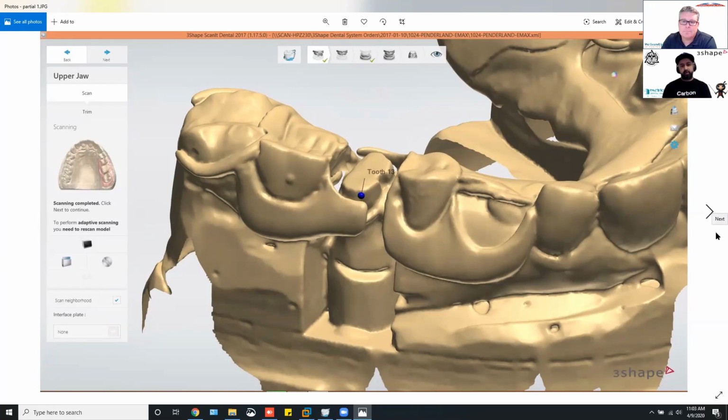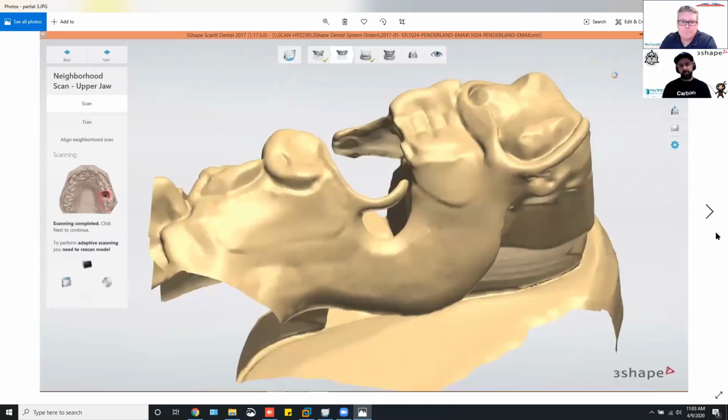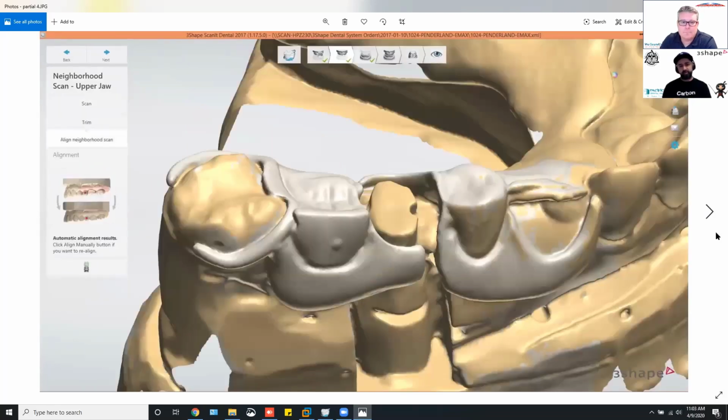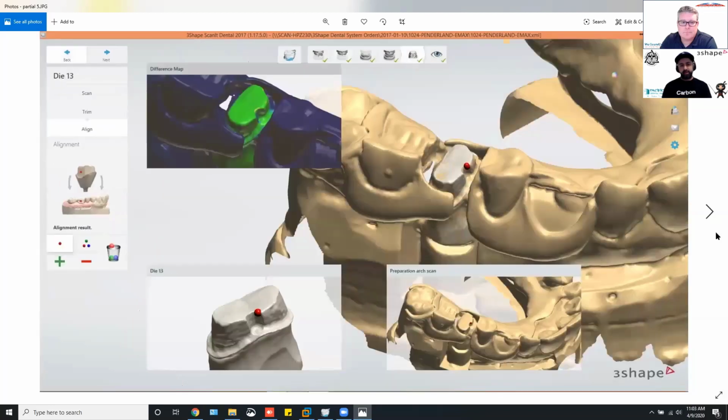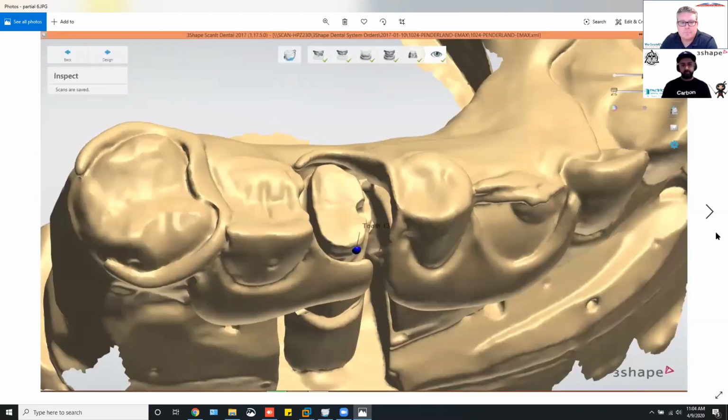We've also got partial scanning with the newer scanners for 3Shape. They're pretty accurate. We can scan with the partial on the model. Then we do a neighborhood scan to get the intaglio side of the RPD and whatnot, align it, and then scan the die, and basically everything looks nice and dandy, and it's really easy to do from there.